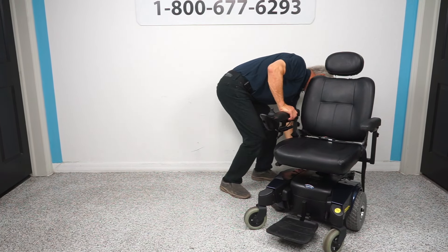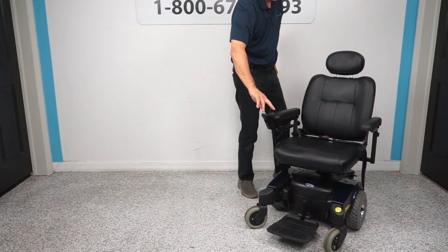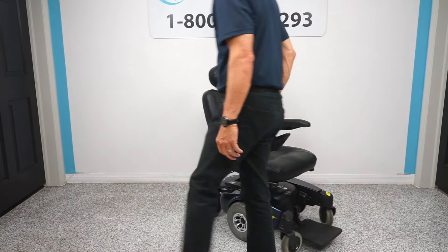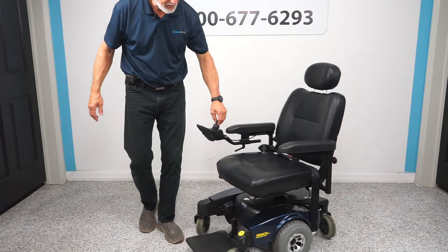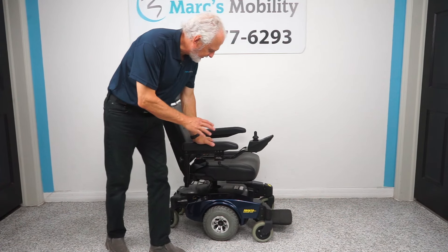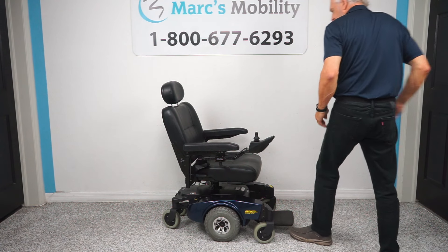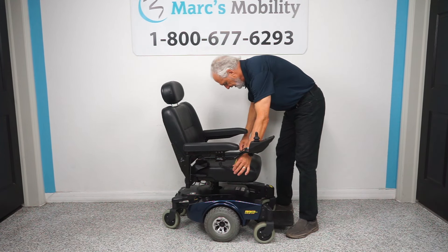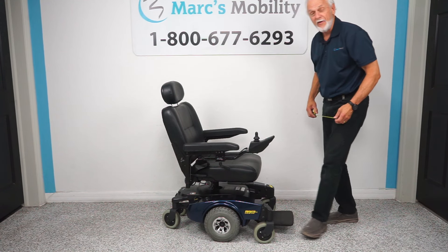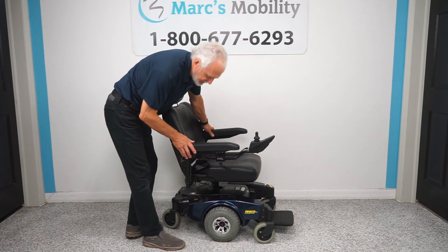Put it back in gear — push the levers in and we're back in gear. So this chair, as I said, is probably used a month or two, practically brand new, Pronto M51. It has a 300-pound weight capability. The seat is 19 by 19, and the outside-to-outside arm width is 25 inches.